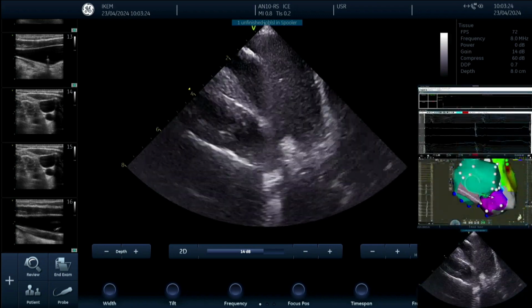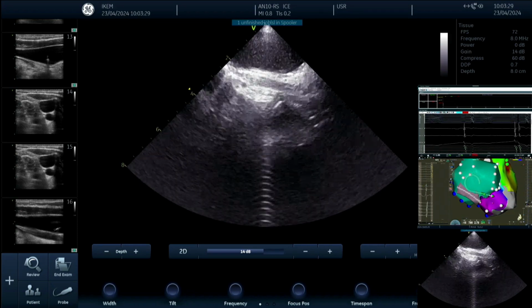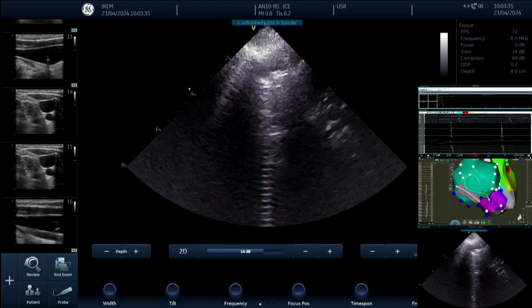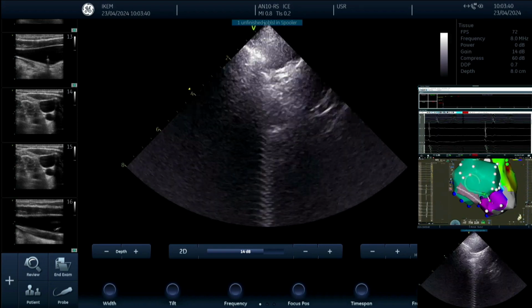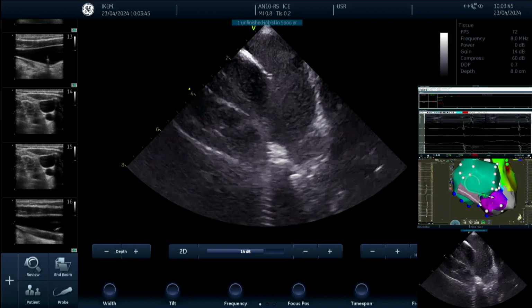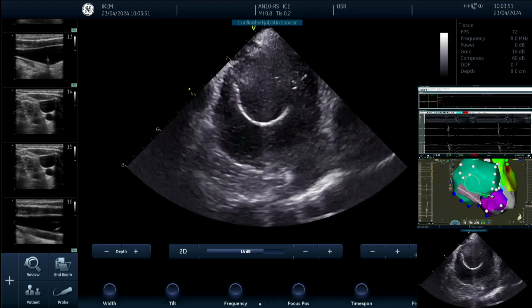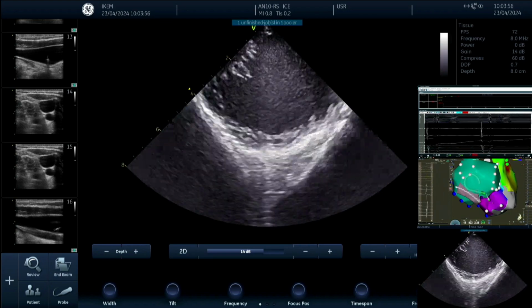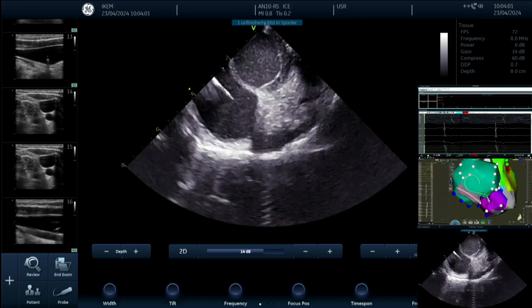You can do it again in the meantime, just to show. Okay. We see a left vein, esophagus, right inferior vein on the left side, and now the superior vein, and next to it is the pulmonary artery. So that's a typical view. This funnel shape is the superior vein, and the inferior vein is on the left side. So it's very close to that area where we are now. You see the appendage here. With the ablation catheter, we're just below the attachment of the fossa ovalis, the lower part of the fossa ovalis.